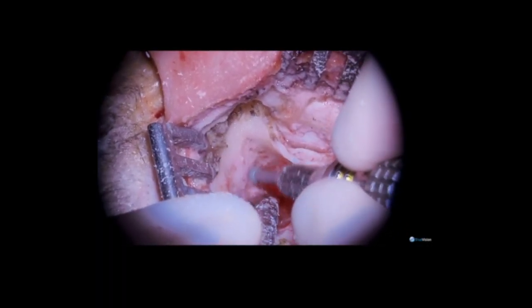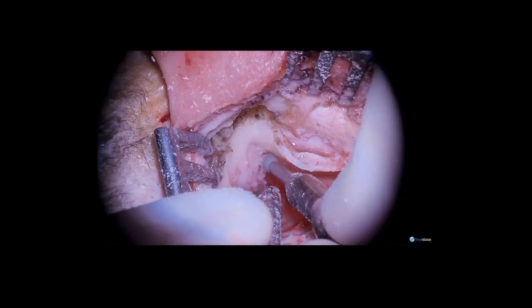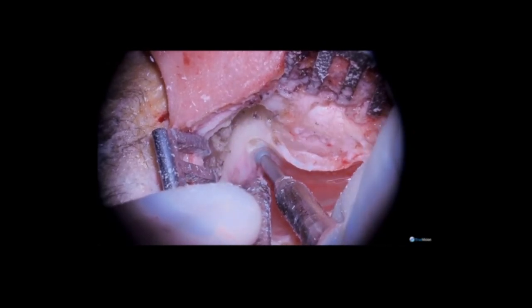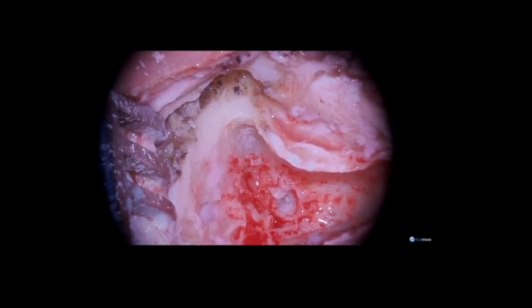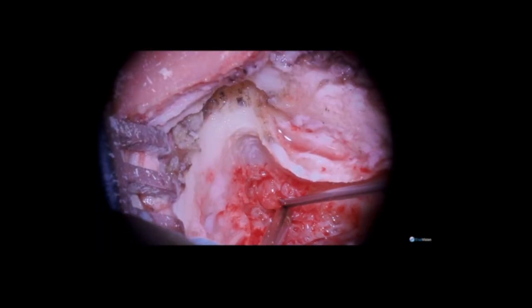I have switched over to a diamond burr to follow the tegmen carefully and open up the epitympanic region in order to access the attic cholesteatoma. At this point, you can see that the cholesteatoma has broken through back into the mastoid cavity. It has also destroyed much of the incus.